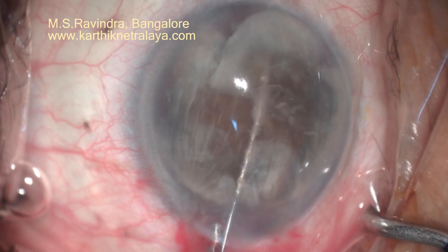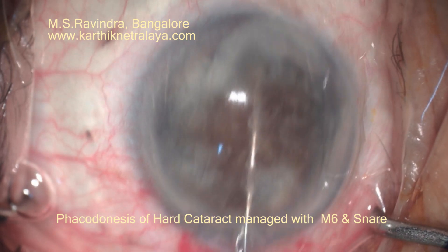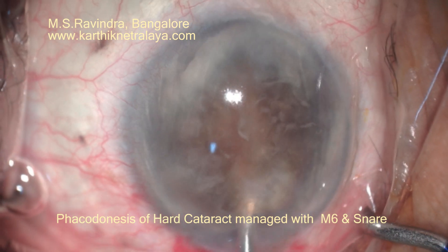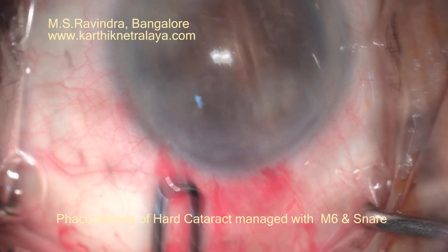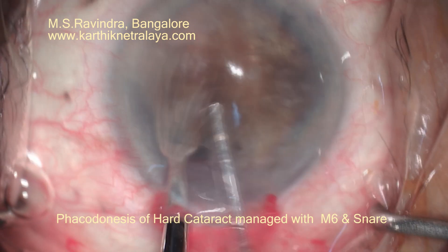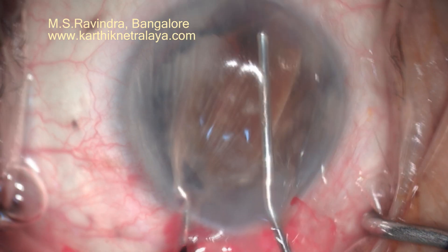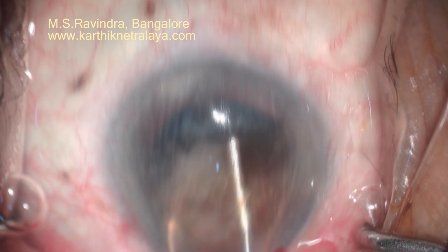I am using a snare, positioned in the middle of the nucleus, and it is very easy to bisect it with the snare. I tried a small narrow vectis, but as you can see it is not possible to remove the nucleus with it.